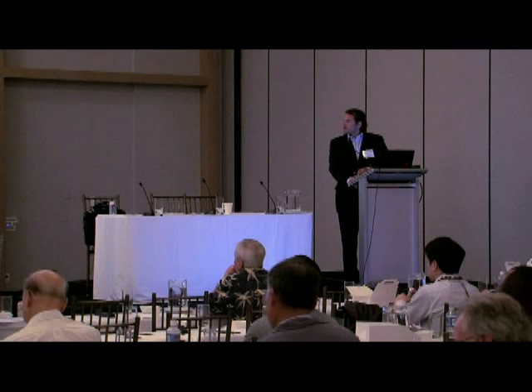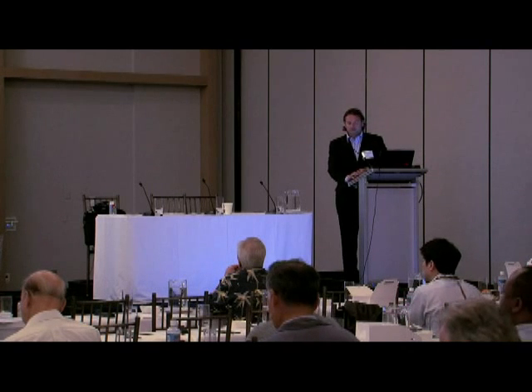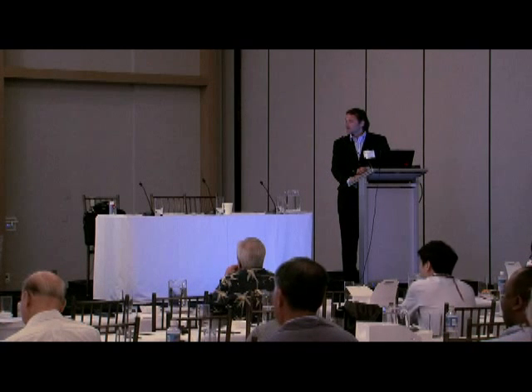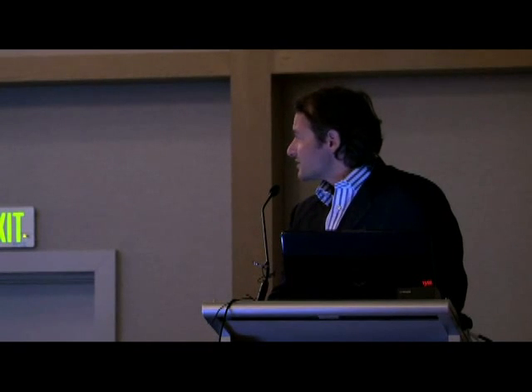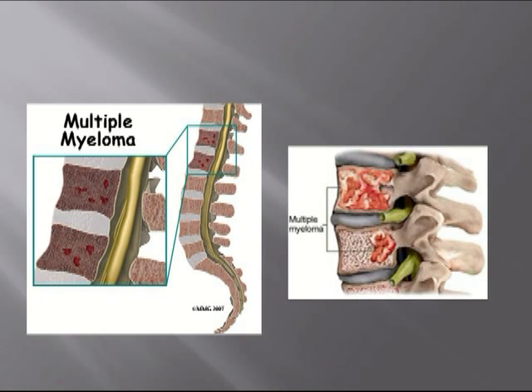These are a little bit advanced techniques, like we use in aneurysms in the brain. You can try balloon remodeling in a way if you need it, especially when myeloma just destroys and invades through the walls of the vertebra.